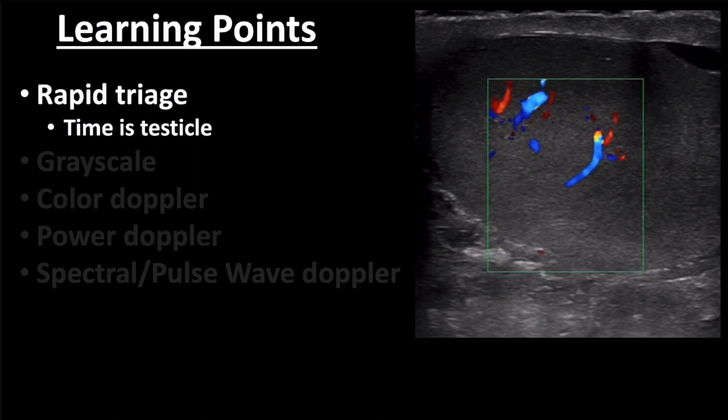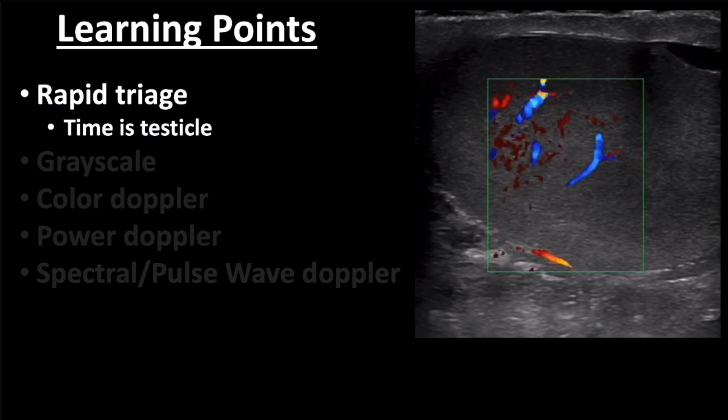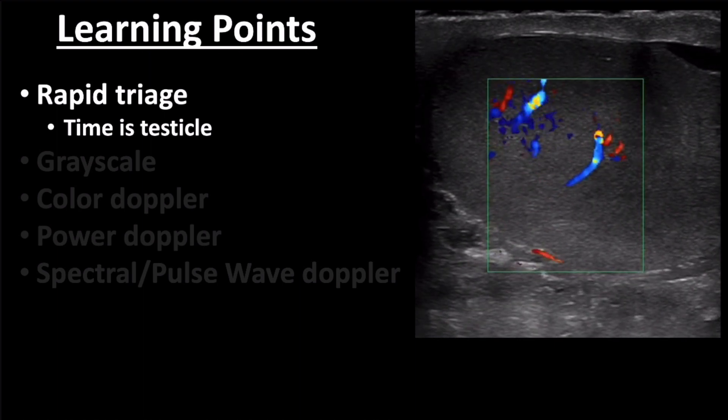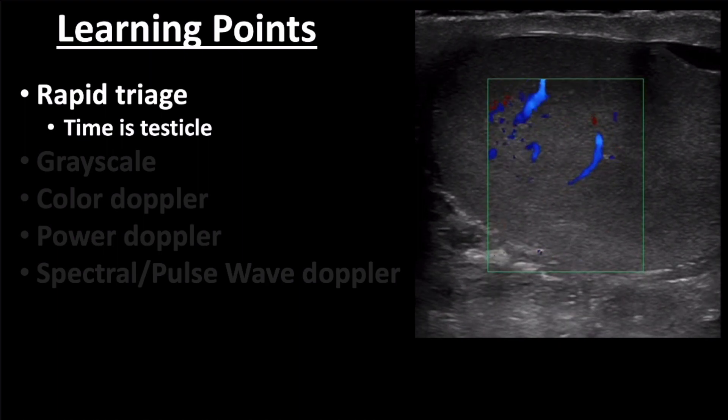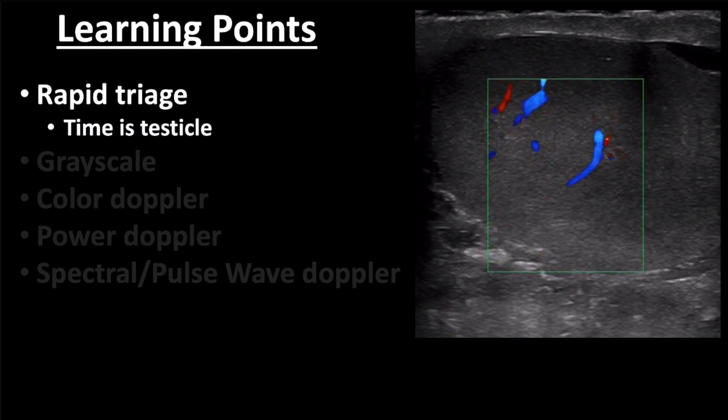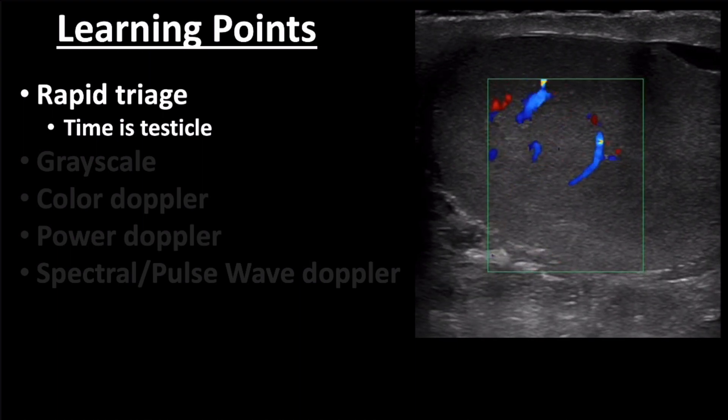I will admit that the evaluation of flow to rule out torsion is slightly more complex than presented here, yet the images I have shown are easily obtainable and interpretable for even the novice sonographer. Just keep in mind that a definitive diagnosis or rule out requires a more in-depth study, which I'll touch on briefly in a second.